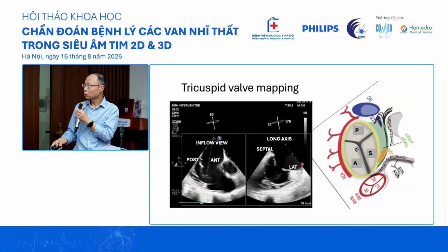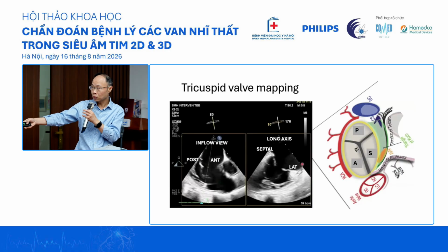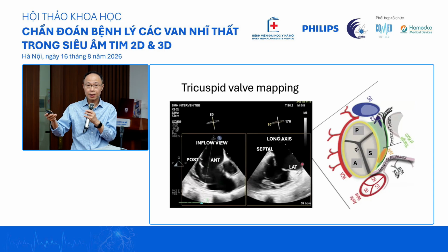Okay, so go a bit deep, deep esophageal, not yet transgastric. Get a pretty nice inflow view. Make sure that you see the aorta over here, and then you turn on the X plane. Then you know where you are. So it's not actually 3D, but it's making use of the 3D principle.